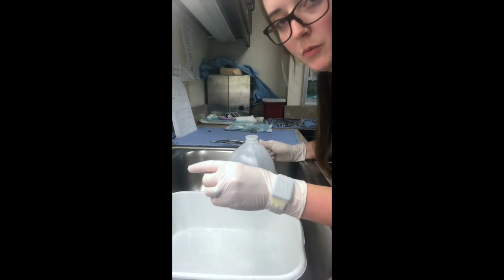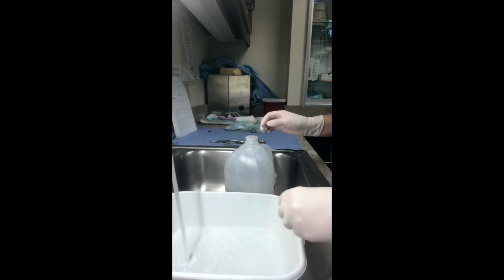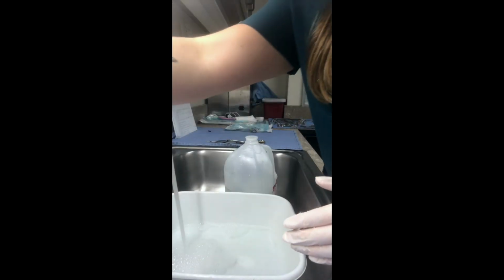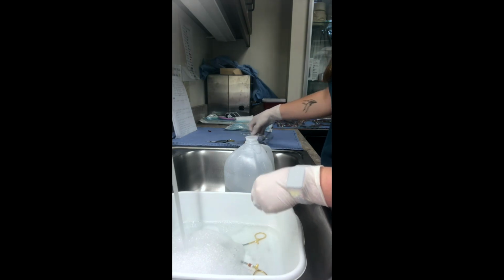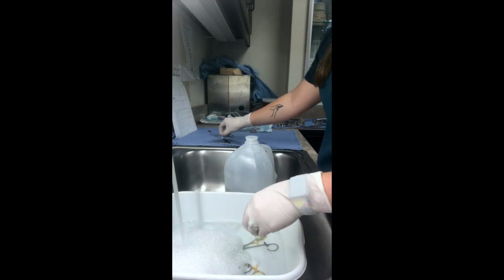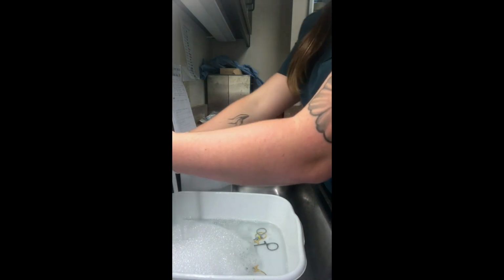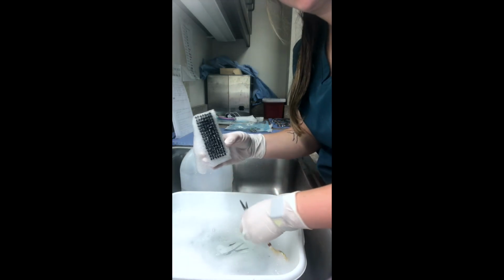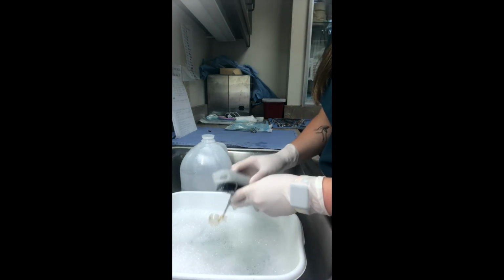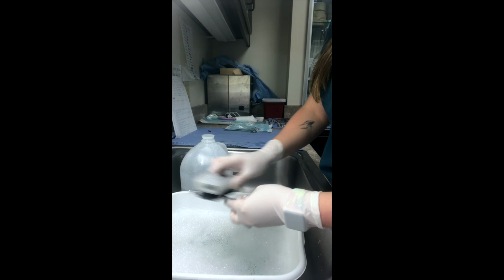So now we're going to do our scrub with some warm water and detergent. With our soft bristled brush, we're going to go ahead and clean these instruments, especially in the crevices and the handles.